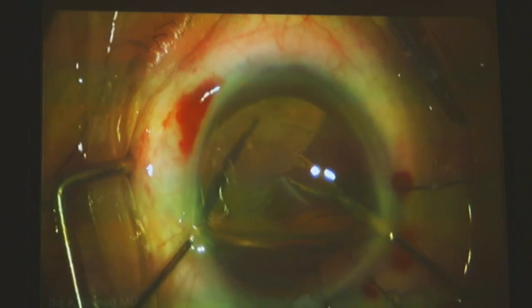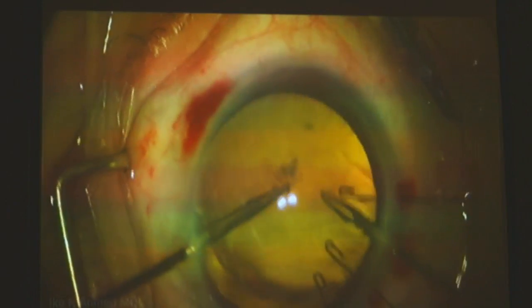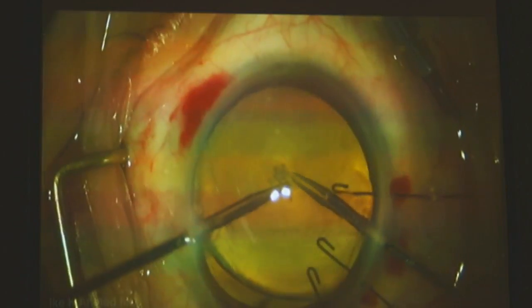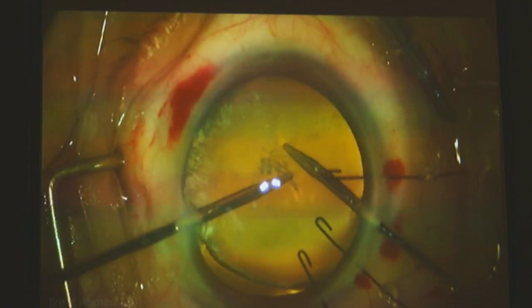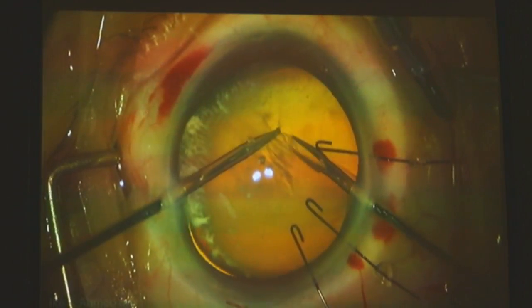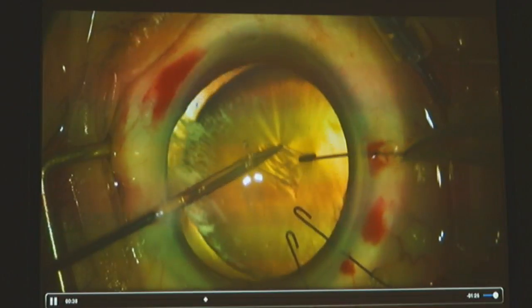This is basically using the understanding of how to do capsulorhexis at the same time as lifting the lens up. Residents, we teach you about doing a nice rhexis using vectors, right? And now we lift up the capsule while doing the capsulorhexis using two hands. You can see there are still a few zonules left. There's some Kenalog that stains the zonules as well in this area.